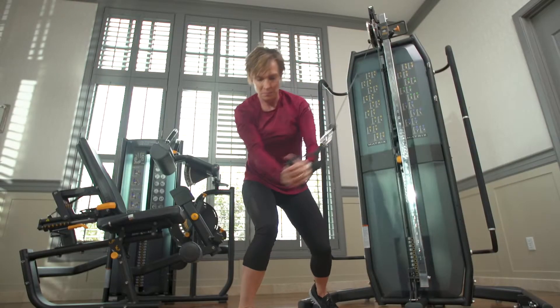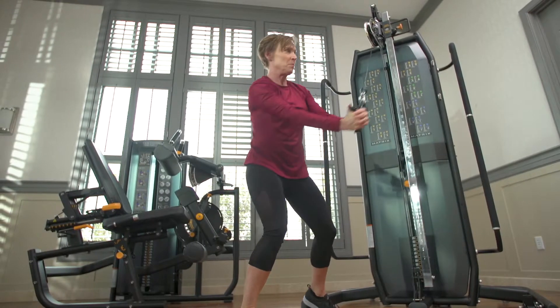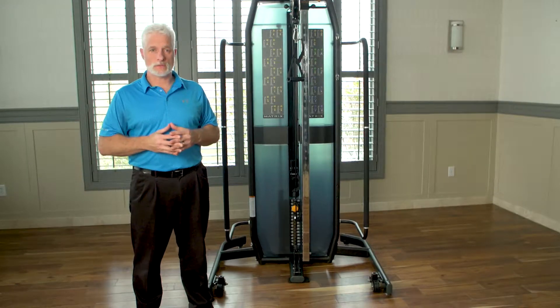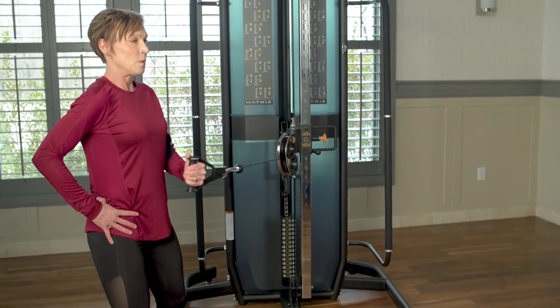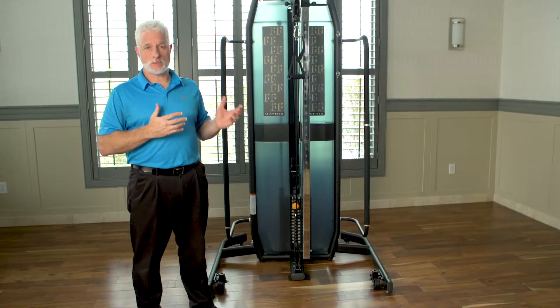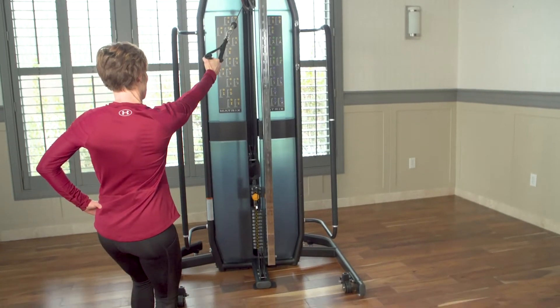This machine provides you with the ability to have variety while you're strengthening, working on endurance, working on balance, and control. Post-surgical rehabilitation in our world is very vast, so when you work with a rotator cuff patient, bicep tendonitis, labral tear, or even impingement, this machine gives you the ability to work on all those different diagnoses in one session.